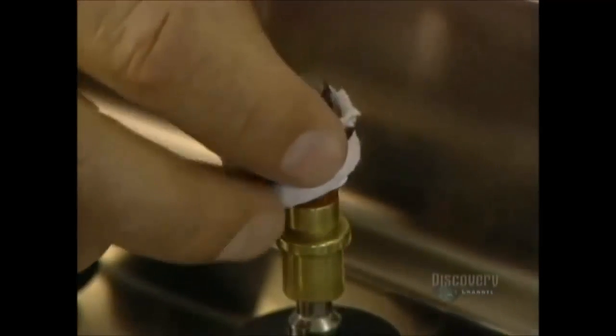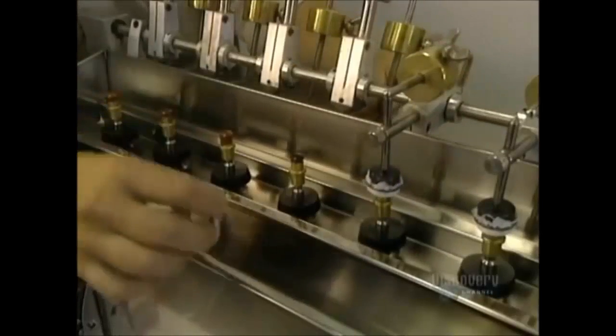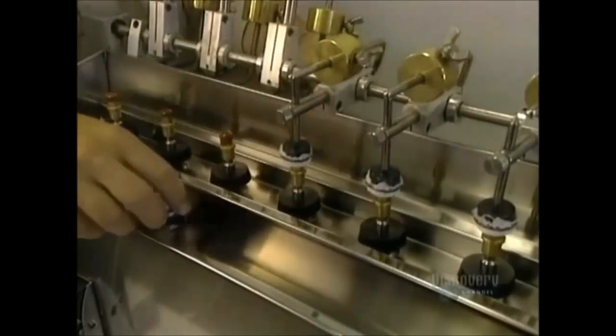They now polish the outer surface of the lens. This polishing, done at high speed, calls for an abrasive paste, some oil, and a small polyester cotton ball.